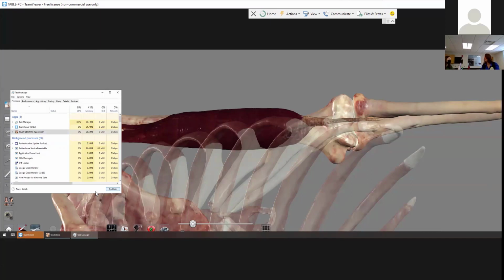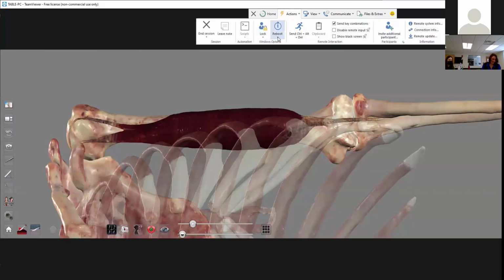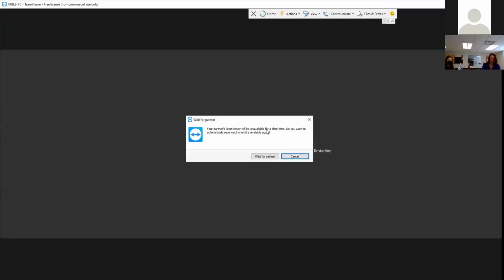When I was on it for 4 hours, it was talking to. Okay. Sometimes if it runs nonstop for like 2 hours or something, it just likes to be restarted. Normally it doesn't run nonstop for 2 or 3 hours unless it's a training or something like that. So let's see here.